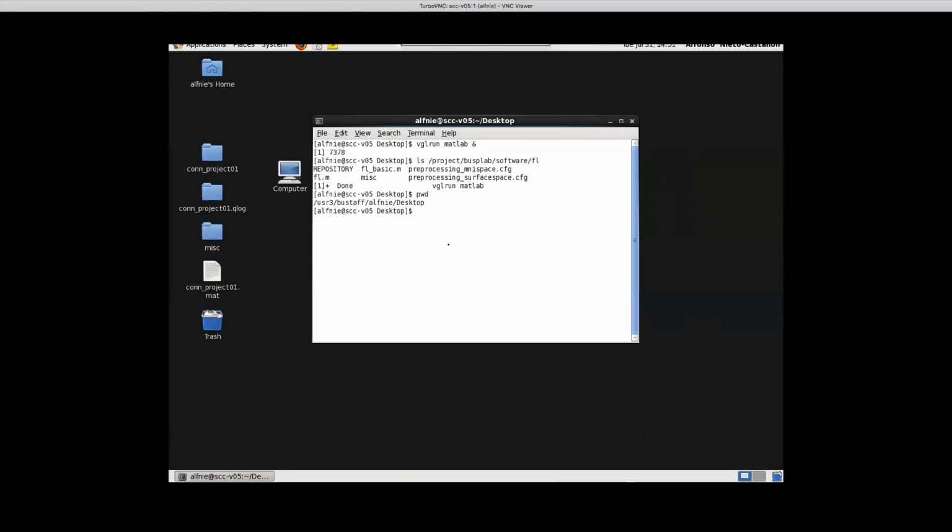But in a practical sense, it would perhaps even make more sense to recompute. Actually, I'm not totally sure, I'll have to double check. I think there might be a version of the surfaces for every subject that is still in the subject space, but has the FS average number of vertices. So it's perhaps easier to interpolate the locations of the vertices in subject space than to interpolate the actual image you want to display on top of that.